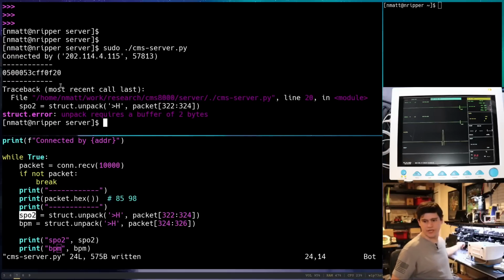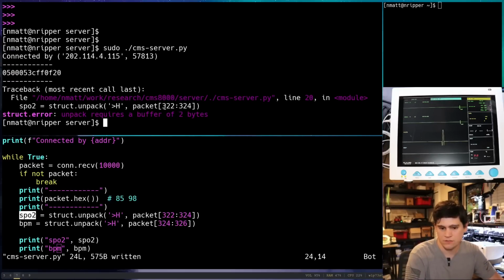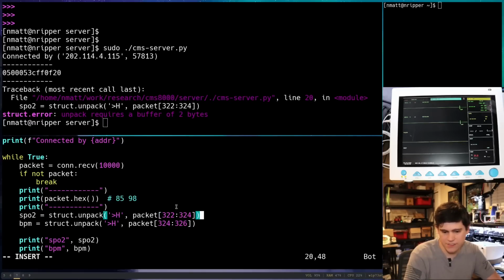Unpack requires a buffer of 2 bytes. Whoa. That's interesting. And it doesn't like me. Okay. Why does it not like this? 322. That looks good. Yeah, this is funny. Why isn't it working? Let's change this back. We're just running hypotheses here right now.